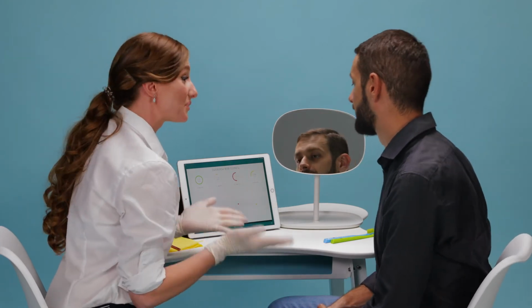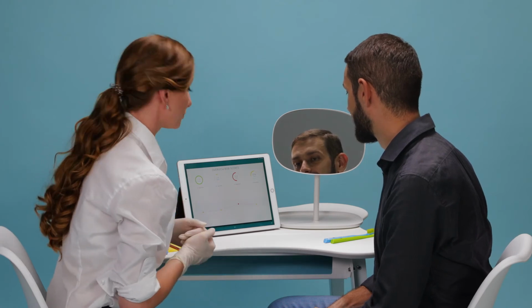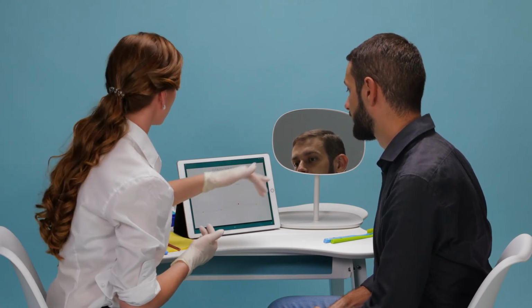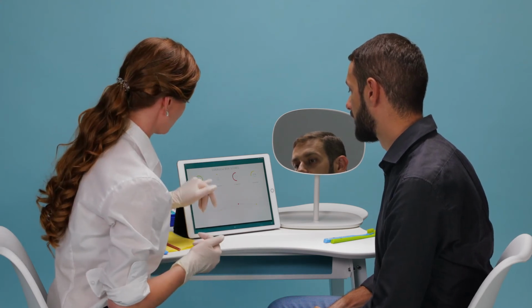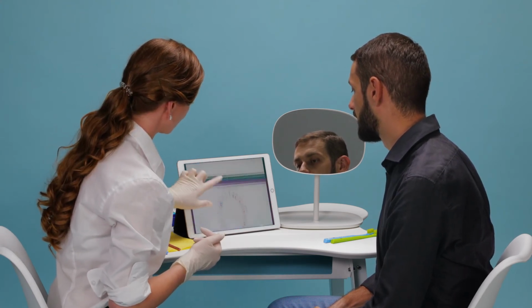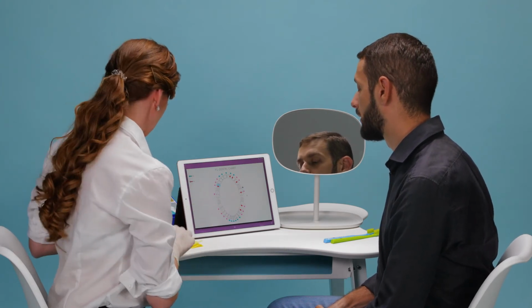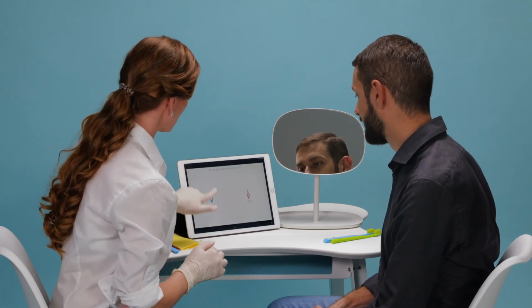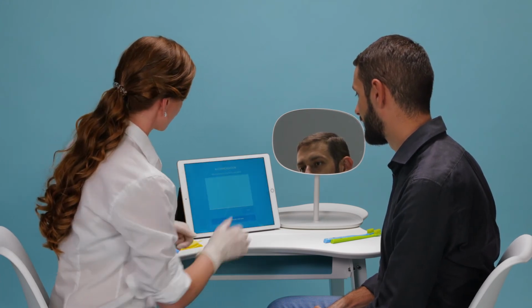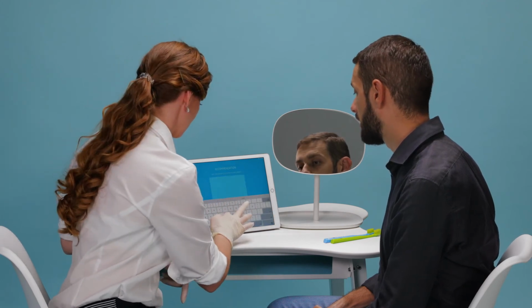We then view his previous BOP scores to discuss his progress and look back at his overall BOP journey. His full mouth map is also there to take a final review and remind him that this is the image he can use at home to support him in using his interdental aids. I then make a note in the comment section to give him a reminder when he gets home.